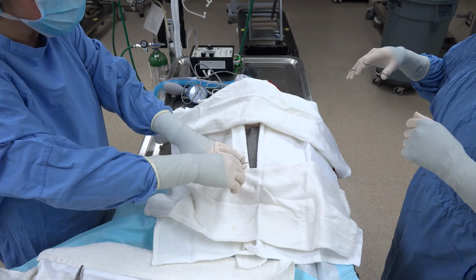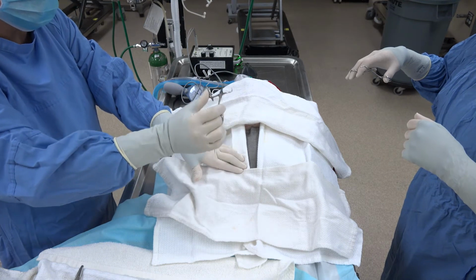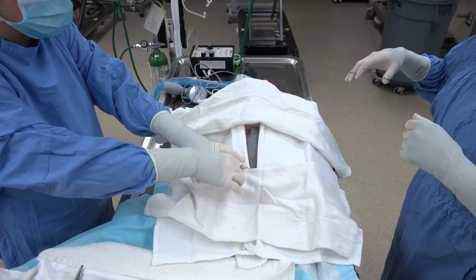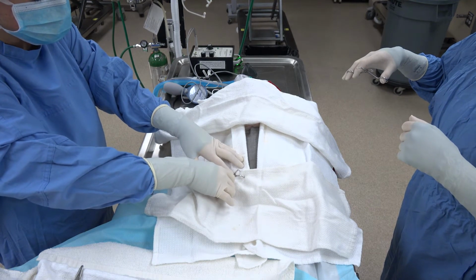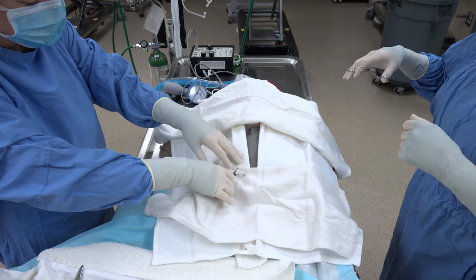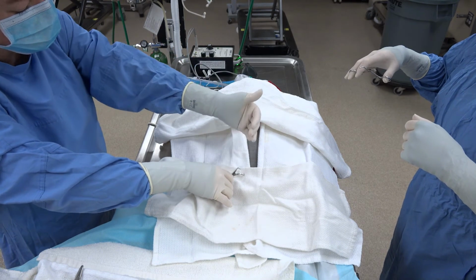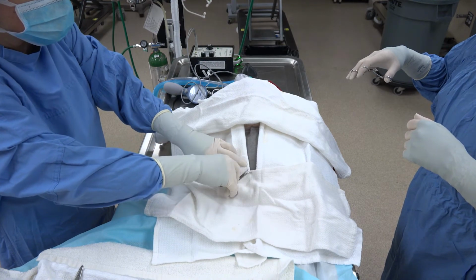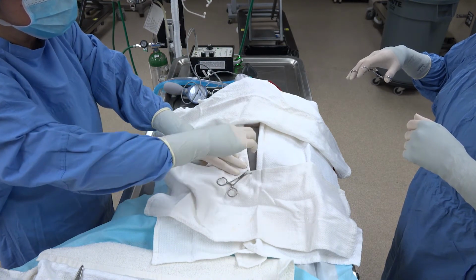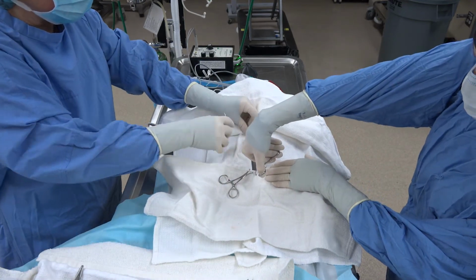Okay, so now I'm going to put my towel clamp in and I'm going to put it obviously in the sterile prepped area because it's going to penetrate the towel and the skin. And I want it close to the edge. If I put it clear back here, even though that might still be in a sterile prepped area, these edges are going to flip up and allow contents of the abdomen to come under the drape. If you put it close, it helps keep a straight line between towel clamps. So we're going to go ahead here and towel clamp the rest of these in.